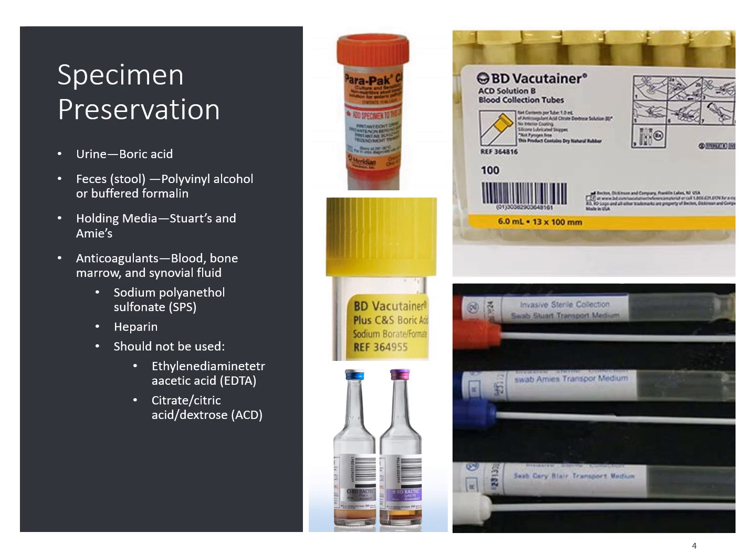So making sure that you use the proper tube is very important, and if you're ever in question, you always need to pull the specimen label back with the patient's name on it, just to make sure that the label on that tube is adequate for that particular specimen or culture that you are performing.